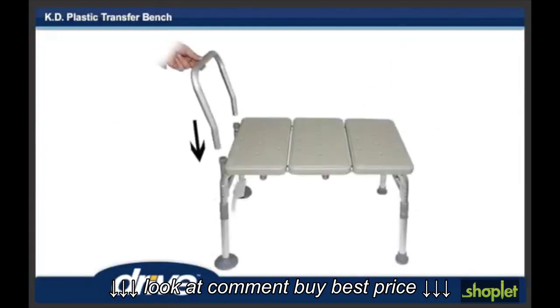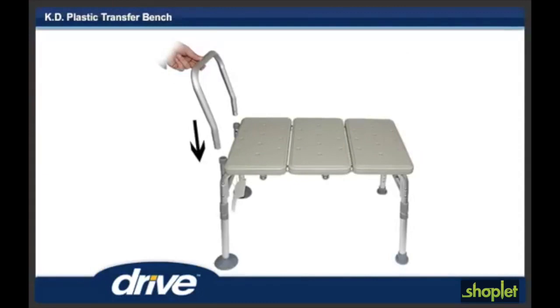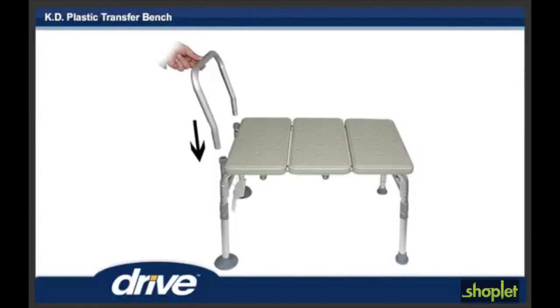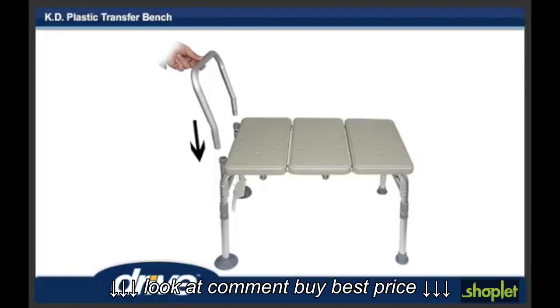Step 5. Turn transfer bench right side up. Attach armrest by depressing brass pushpins and sliding into the arm receptacle on the side of the bench. Make sure the arm arcs outward, not inward.